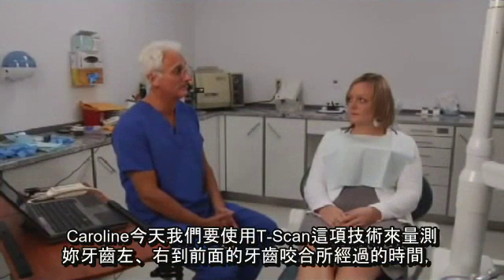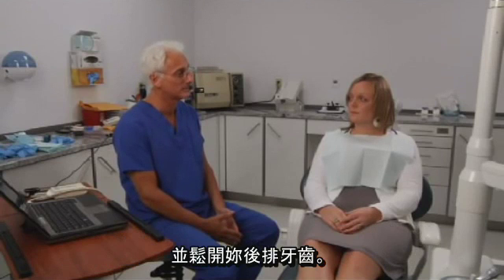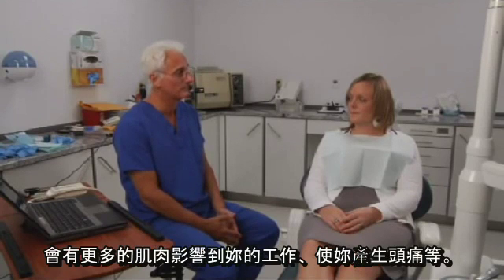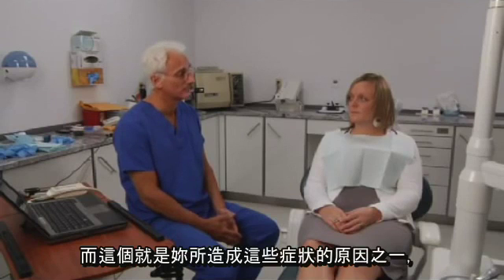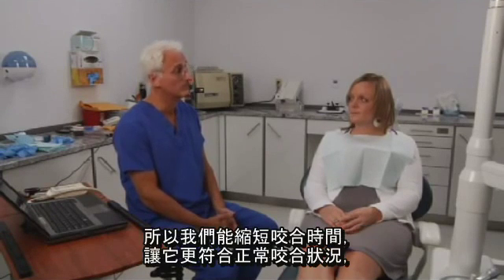So Caroline, today what we're going to be doing is using the T-scan technology to measure the elapsed time that it takes you to move left, right, and forward and separate your back teeth. And the longer your back teeth don't disengage, the more muscle firing that your jaw creates for your head. And that's one of the causes of all these symptoms. So with the T-scan technology, we have the ability to measure it very precisely and understand how to change it so that we can shorten that time down to where it's really physiologic for you.